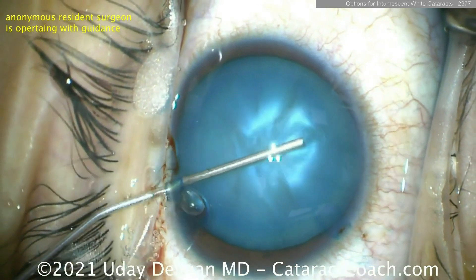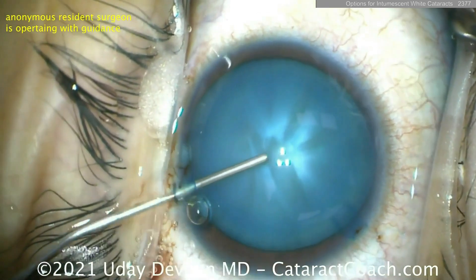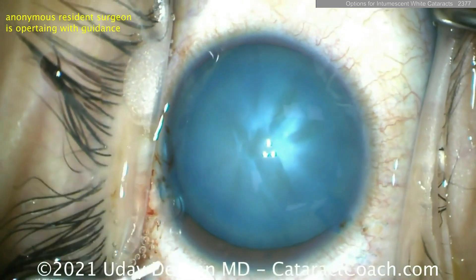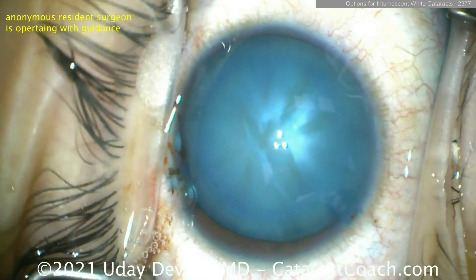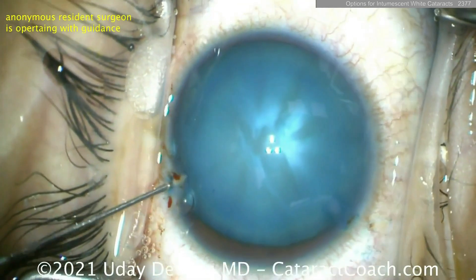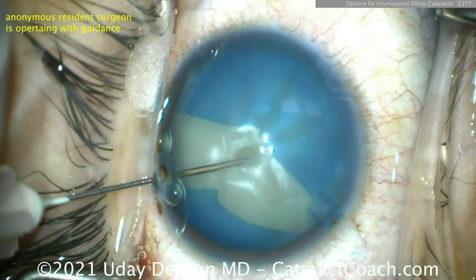What about this one? Look — it's extra pressurized, super pressurized. This is the danger one. With this extra pressurized capsule, there's so much pressure within the bag that even if we go in with a deepened AC and a highly pressurized AC, as soon as you hit it with the needle it's going to break.